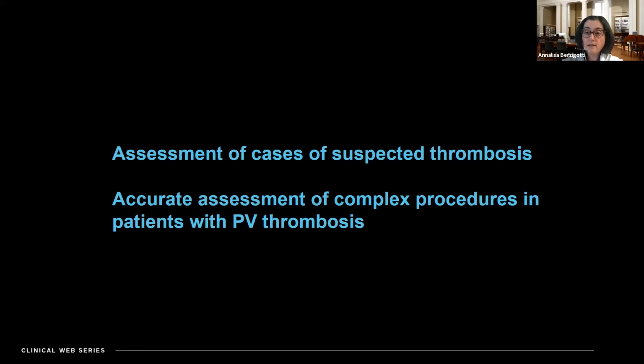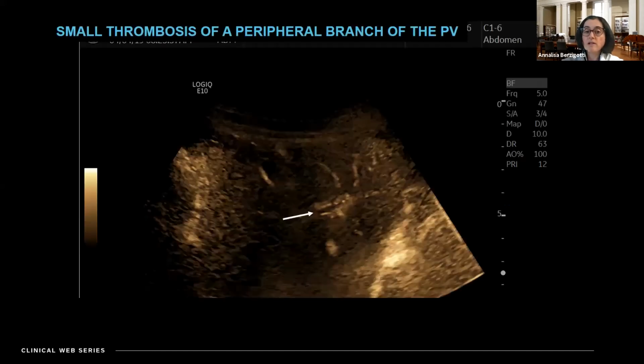So we had a few months ago a patient that was in our ward for a cholangitis, and there was a bit of increase of liver enzymes, and the question was whether he could also have some thrombotic problem. We could rule out a major portal vein thrombosis, but what is interesting to see with this technology is that you can see in the peripheral branch of the left portal vein a lack of flow, which is characteristic of portal vein thrombosis.